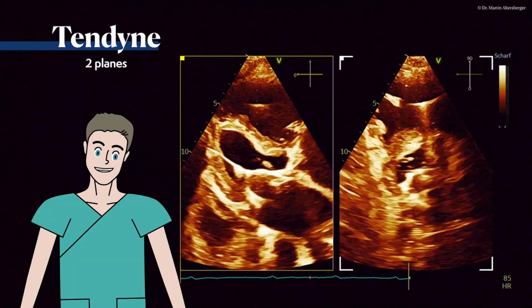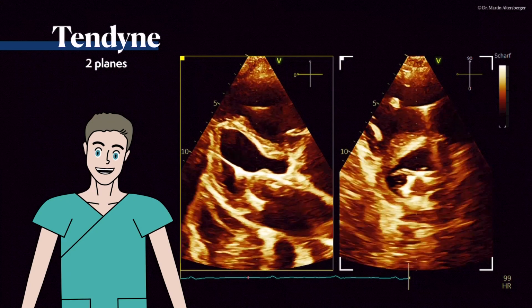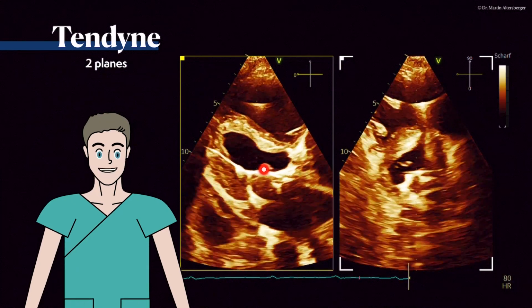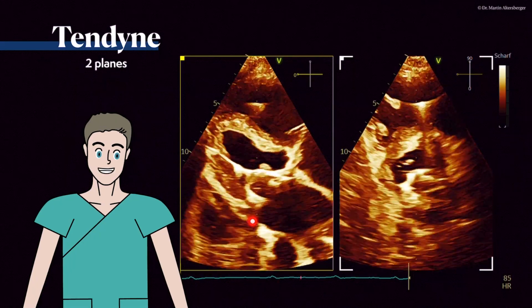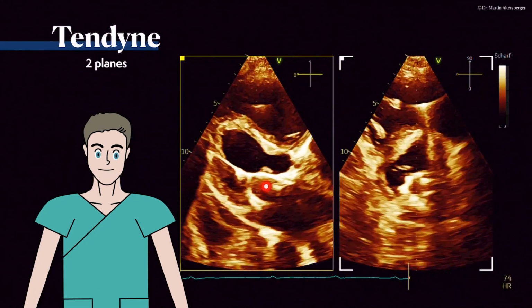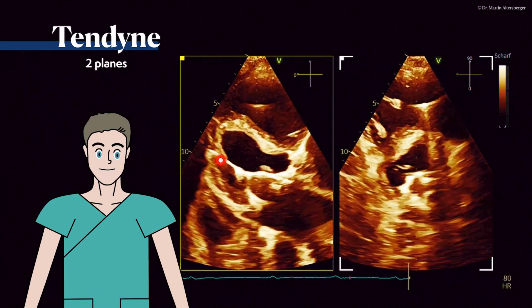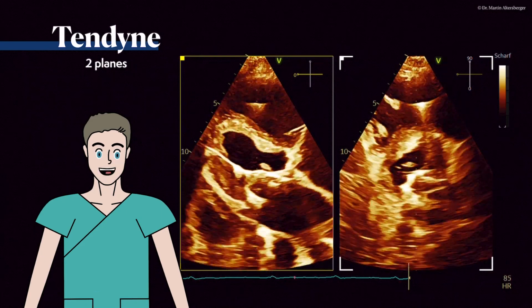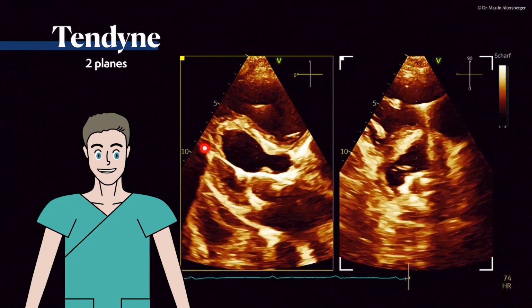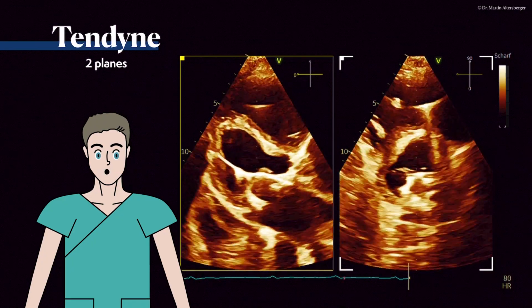So first of all, what is the Tendyne valve? This is another patient where you see the valve over here. These are the remnants of the mitral valve, the anterior and posterior leaflet, and there's this huge umbrella-like structure and the actual valve inside here, and here the fixation with a cap at the apex, or more the apical regions.